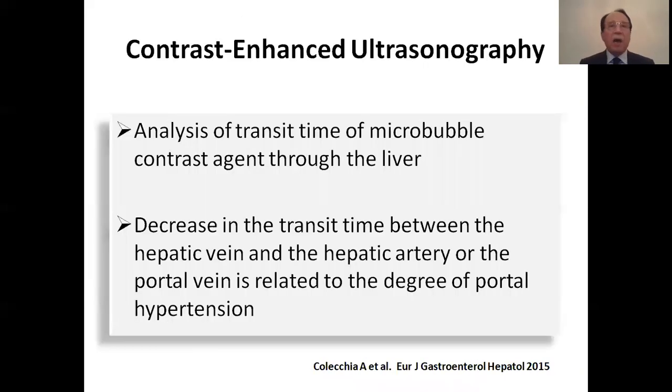Contrast enhanced ultrasound is applied to differentiate diffuse liver disease and assess the severity of portal hypertension. Recent studies show the diagnostic abilities of contrast parameters based on dynamic microbubbles for portal hypertension. Contrast-enhanced ultrasound provides analysis of transit time of microbubble contrast agent through the liver.